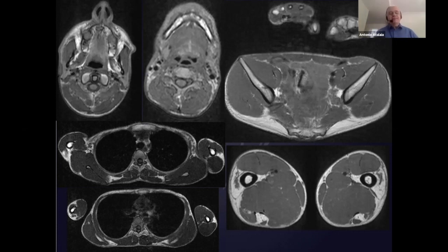But I know one thing, it's that for the future of having the means to run clinical trials, we will need to have biomarkers, and potentially the MRI offers several points where we have measurable alterations, and we can repeat the test over time.